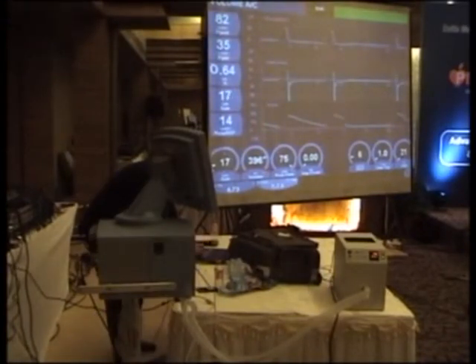Acutely, while you are providing this initial adjustment of the ventilator, but as soon as you can, these patients will probably have the best lung mechanics if you put them in a pressure support CPAP mode where they can determine what is the best rate for them, and then adjust the pressure support to give them the tidal volume they need to achieve adequate, not perfect, ventilation.